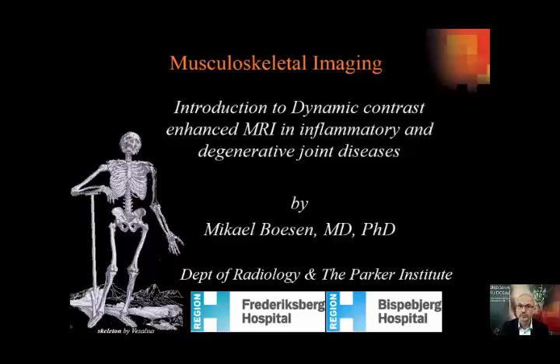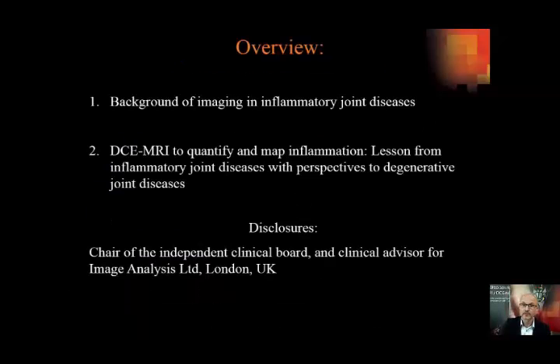Hello and welcome to this introduction to dynamic contrast enhanced MRI in inflammatory and degenerative joint disease. The overview of the presentation is first of all a little background about imaging in inflammatory joint diseases, then a short introduction to how we use dynamic contrast enhanced MRI to quantify inflammation and how we map it. And I will try to give you the lessons we learned from inflammatory joint diseases and then cross over with perspective to degenerative joint diseases.